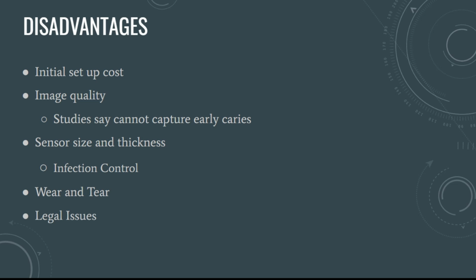And there are legal issues associated with digital imaging. Because you can manipulate the image or you can enhance it, some are saying that it's questionable if it needs to be used as evidence in a lawsuit.